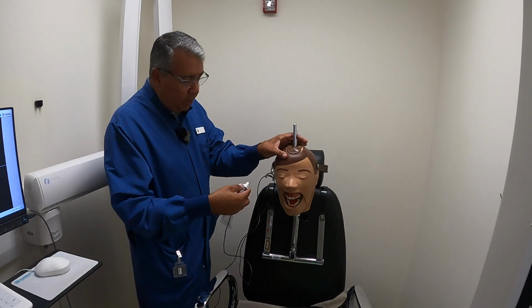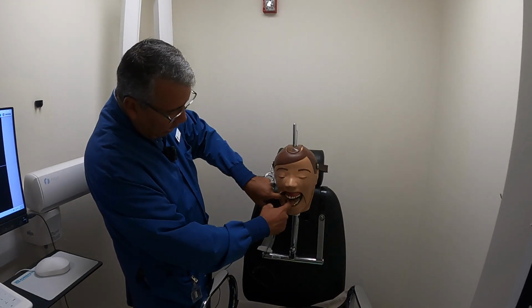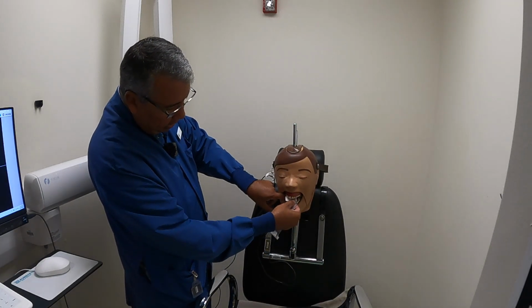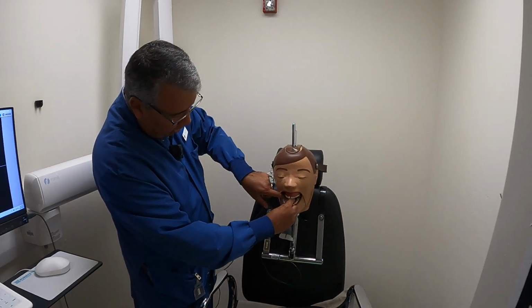Okay, so we know what we need to get. So we're going to take the patient's tongue, move it out of the way. We're going to take this, place it in the patient's mouth as flat as you can, and rotate it in the patient's mouth.